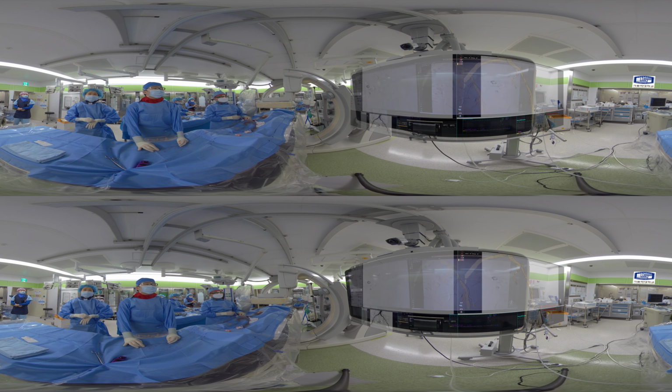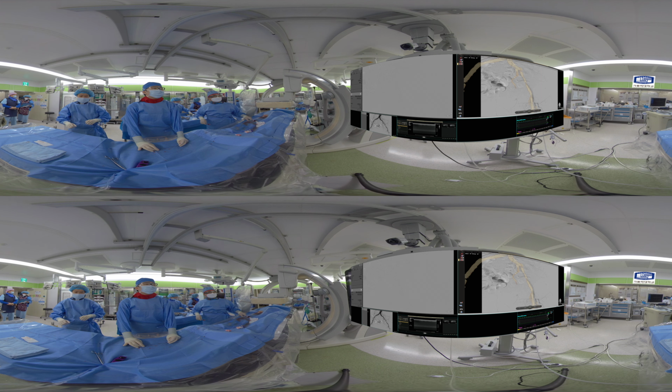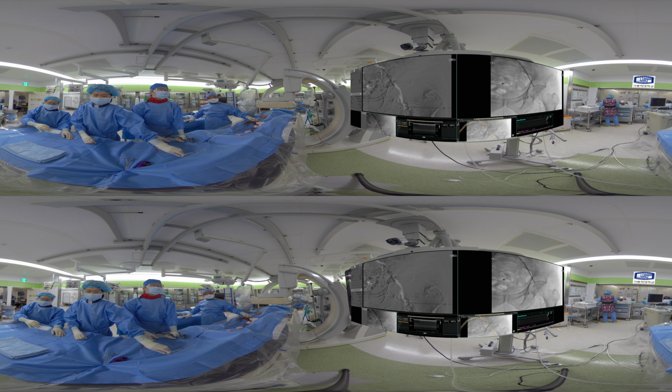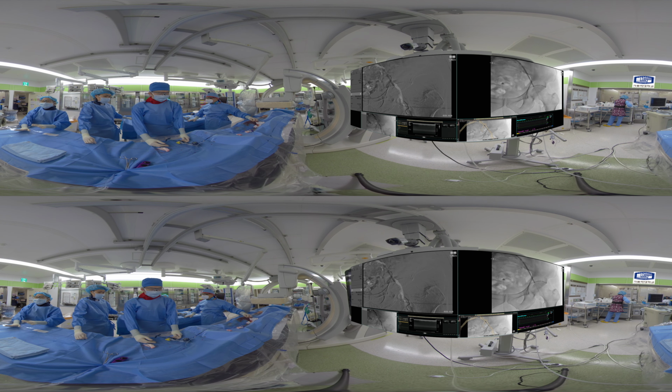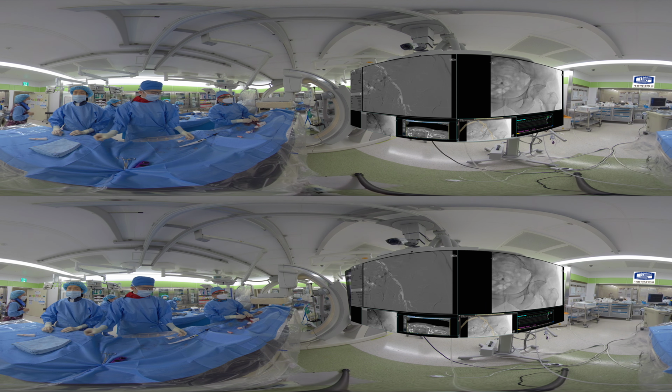Ankle brachial index was 0.5 in the right leg and 0.3 in the left leg. CT angiogram showed ISR lesions in the left iliac artery and left SFA. The patient was sent to the hybrid operation room and skin preparation was done in the right groin. A crossover retrograde approach from the right to the left iliofemoral artery was done for revascularization.